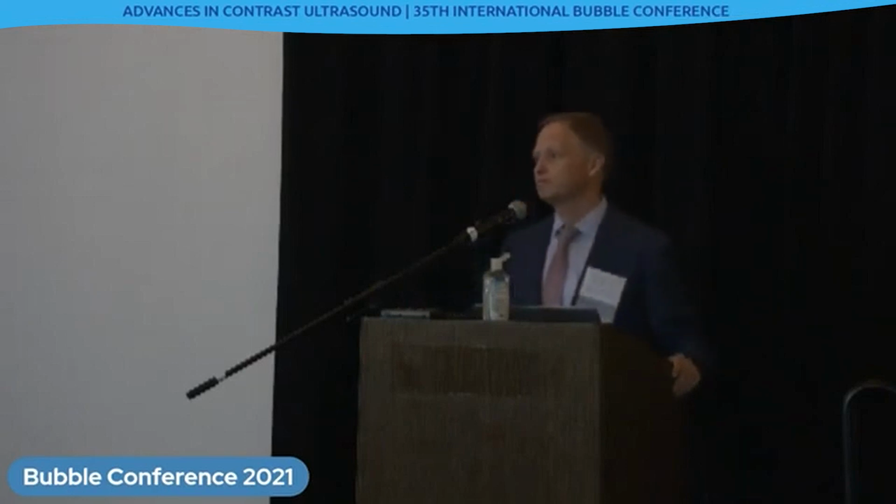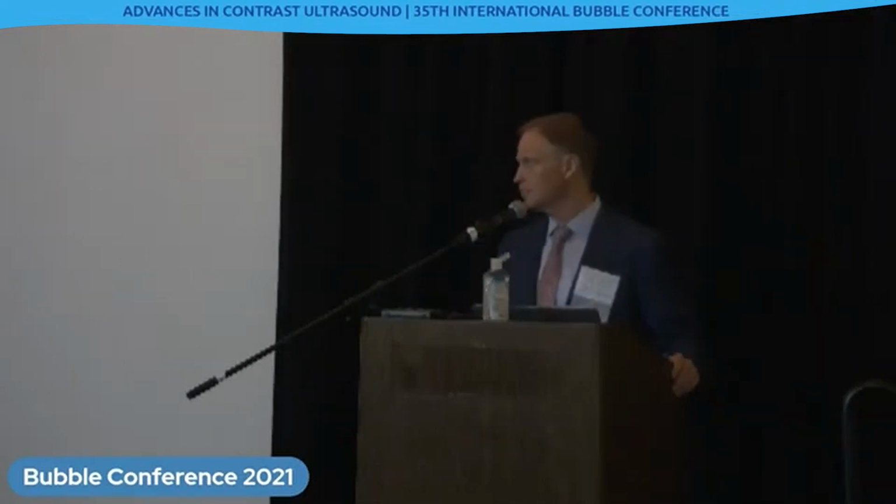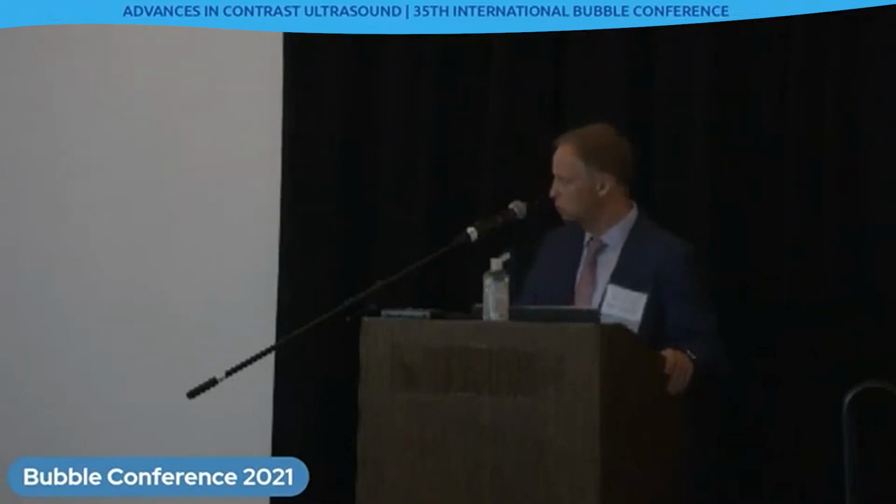Just one other question, if you could comment on the sensitivity in this high-risk population. Because basically, are we not telling people with LI-RADS 3 and 4 that they don't have anything wrong and sending them home? No, absolutely not. When we have LI-RADS 3 and 4, we tell them there is something wrong. We don't know exactly what it is. But a lot of those had malignancy at the time. Yes, you're correct.